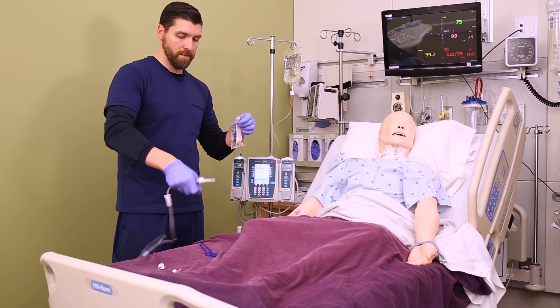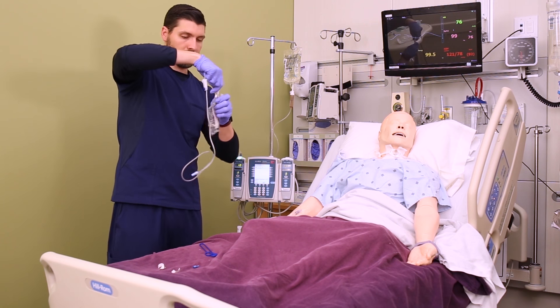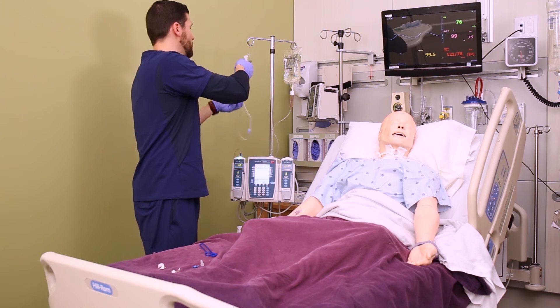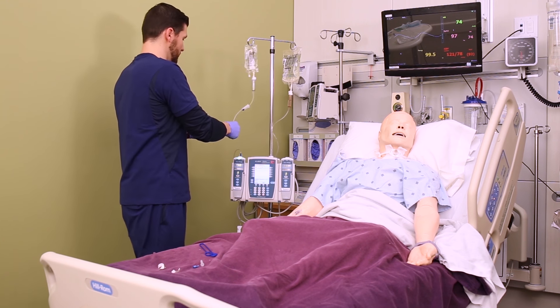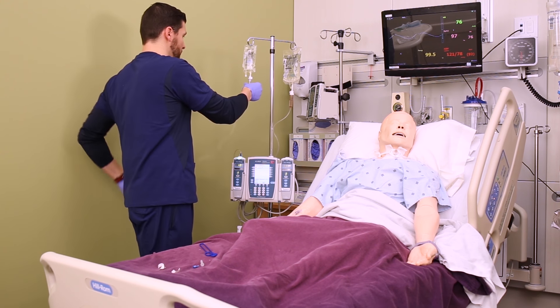Then you'll need to spike and prime your secondary med bag. You can use a trash can or the sink to prime over, and once you have it fully primed you're going to clamp the tubing. Go back and watch the spike and prime lesson if you need a refresher on how to do this part.